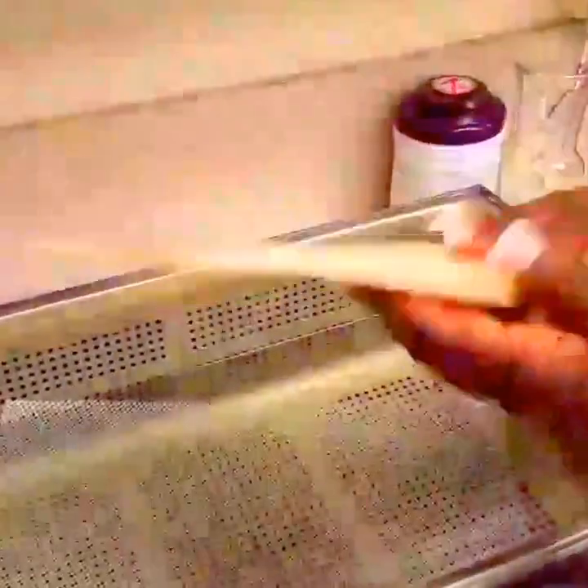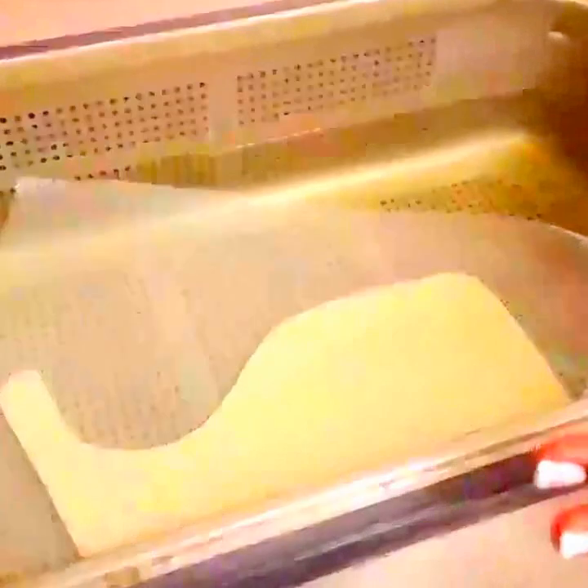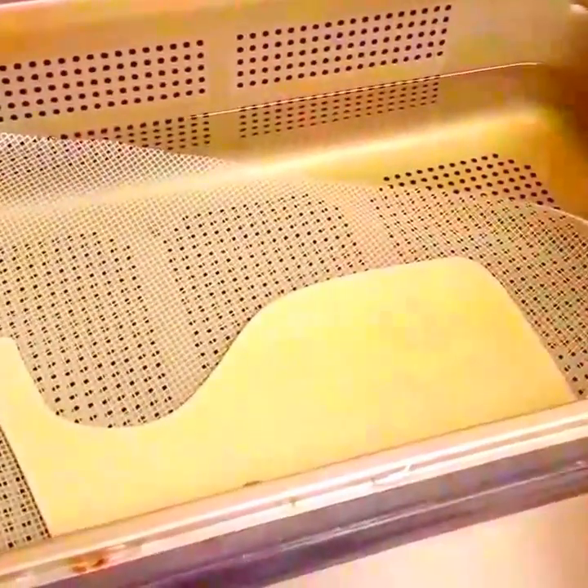Once you've cut your splint out, go ahead and put it in the splint pan to soften the splint material to make it moldable. We've now transferred the pattern onto the splint material and cut our splint out.